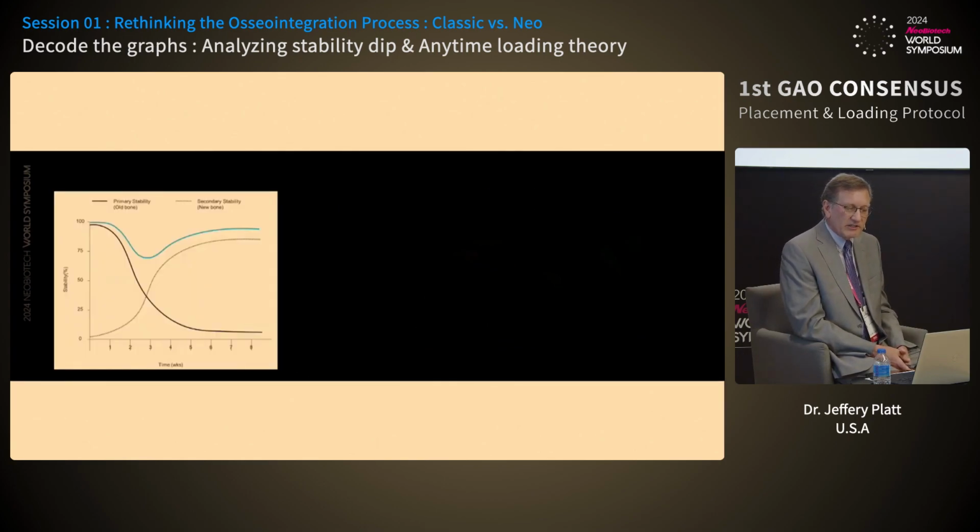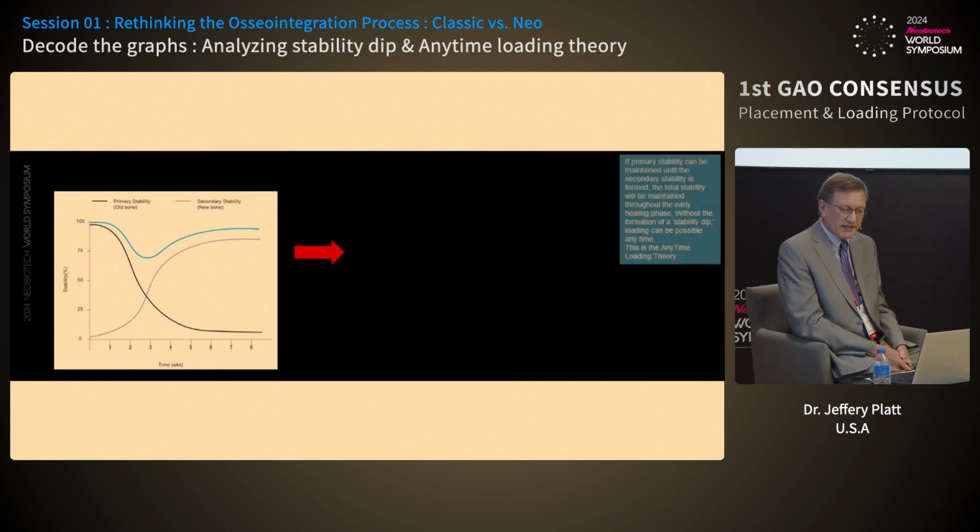Rather than Dr. Ha going to the self-tapping type of implants, he stayed with the tap drill design because he knew that the tap drill and being gentle to the bone in the osteotomy was so important to enable the osteotomy to not have pressure necrosis created.